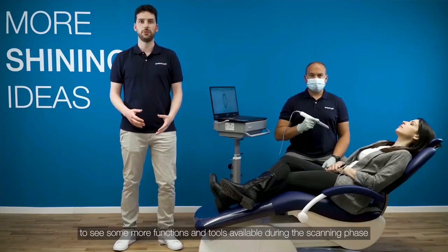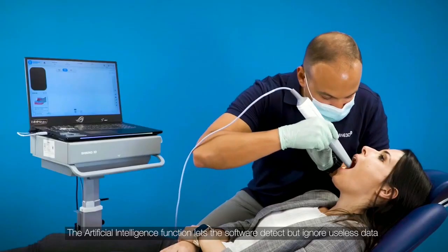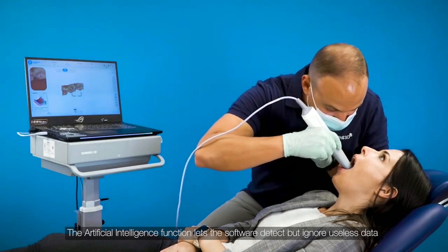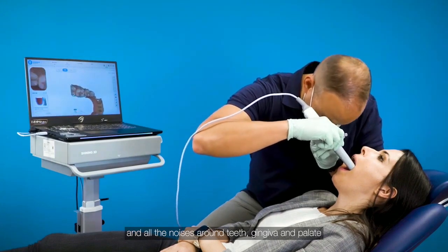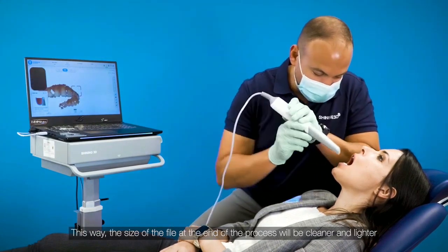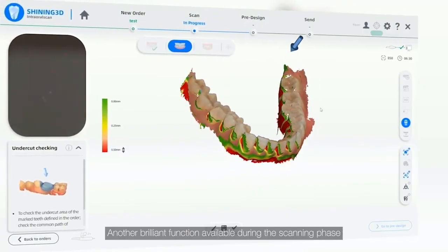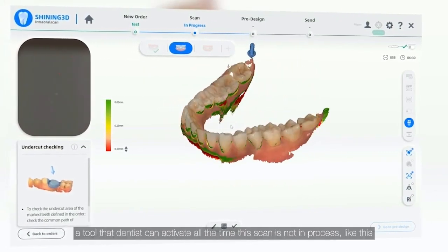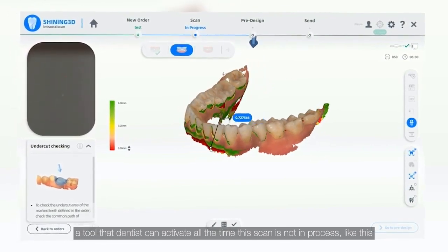Let's move on to the next step, to see some more functions and tools available during the scanning phase. The artificial intelligence function lets the software detect but ignore useless data such as tongue, cheeks, dentist fingers, and all the noise around the teeth, gingiva, and palate. This way, the size of the file at the end of the process will be cleaner and lighter. Another brilliant function available during the scanning phase is for sure the tool to check the undercuts, a tool that dentists can activate all the time the scan is not in process, like this.